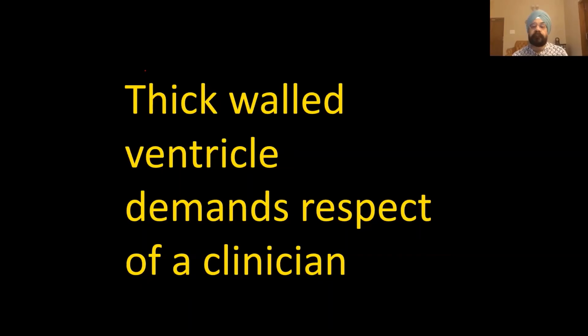Absolutely. Do we, sir, classify left ventricular hypertrophy into mild, moderate, and severe? Well, one could do it, although I have not seen any typical classification. You could do it actually. I would say that you could take criteria of 12 to 15, 15 to 20, 20 to 25, but I have never seen this being used. I have interacted with a lot of experienced people. When they write severe concentric hypertrophy, they actually mean wall thickness exceeds 20 millimeter.